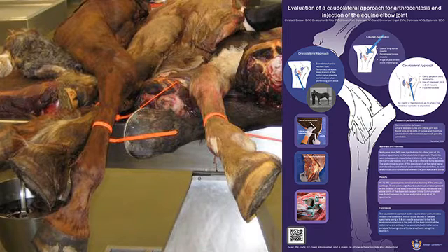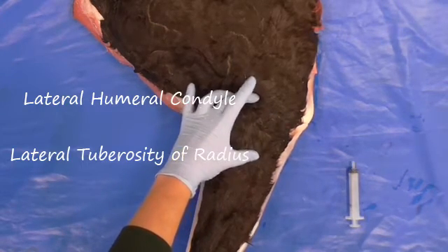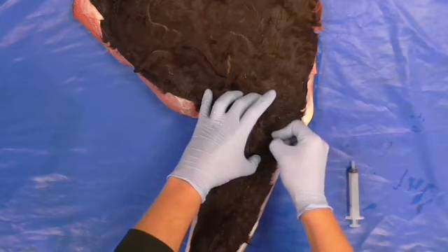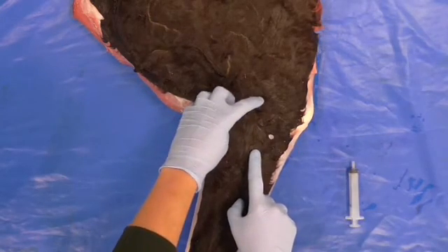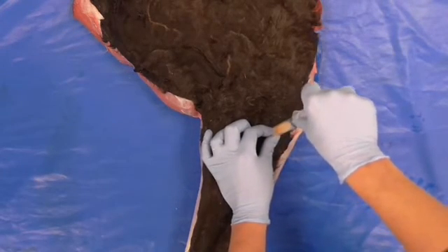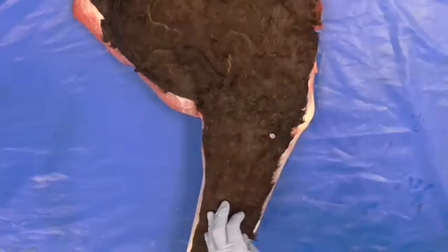So we performed a study using 70 cadaver limbs, identifying the bony protrusion of the lateral humeral condyle and the lateral tuberosity of the radius. Then measuring about two-thirds of the distance down from the humeral condyle, caudal to the collateral ligament, where the bony ridge can be palpated. A 20-gauge, 1.5-inch needle was advanced perpendicular to the skin into the joint until the hub of the needle touches the skin. Fluid was easily aspirated and then 10 ml of methylene blue solution injected.